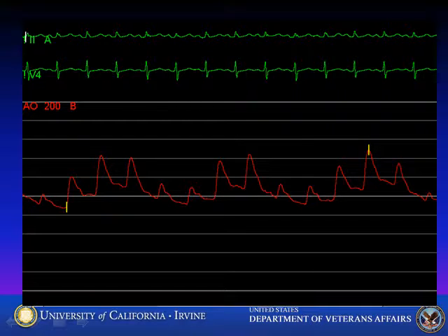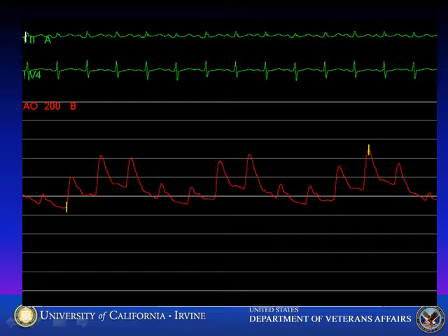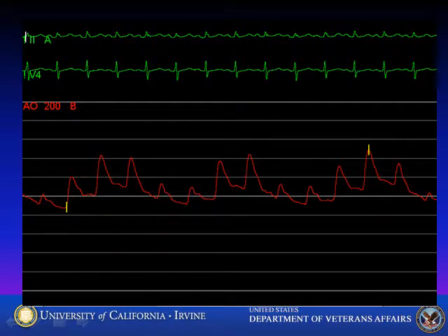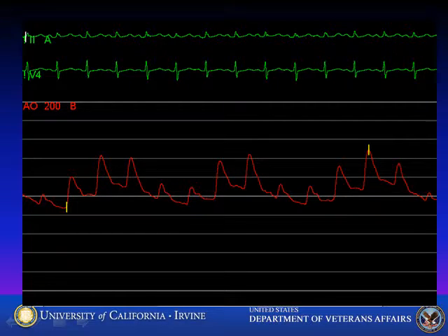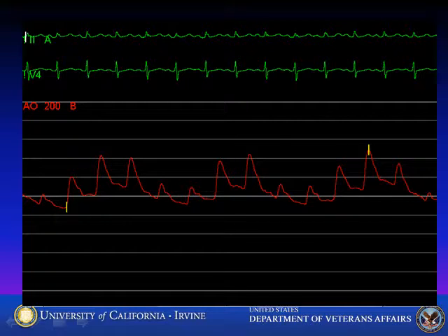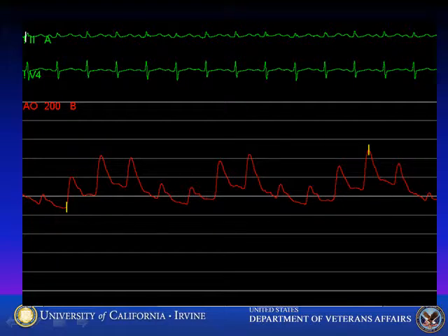The arterial pressure in the intensive care unit is shown here; the scale is 200. You can see the marked respiratory variation and the exaggerated drop in systolic pressure during inspiration of 30 to 35 millimeters of mercury. This is a typical example of pulsus paradoxus, which is relieved after tamponade is cured.